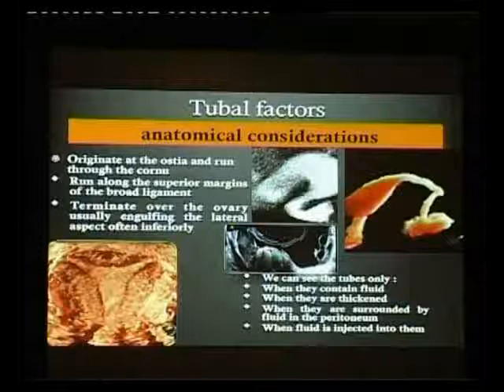These are the cervical polyp, and then we can use the power Doppler in the cervix. Like in this case, there's a mass lesion, and once we use the power Doppler, we know that the vascularity is increased. Also, examining the cervix as a result of cone biopsy of that patient, atrophy of the cervix, radiations, the history of radiations given to that patient, or the history of malignancy is important to assess the cervix. And this is usually detected clinically, but there may be a presence of mass which may be confused with a fibroid.